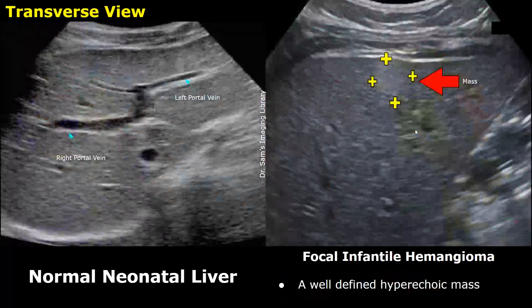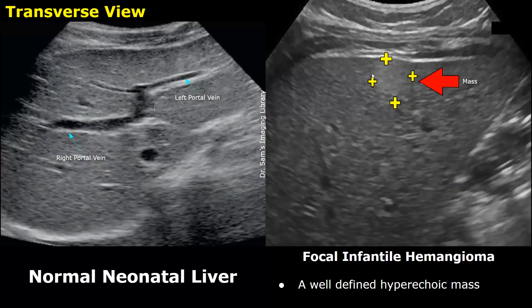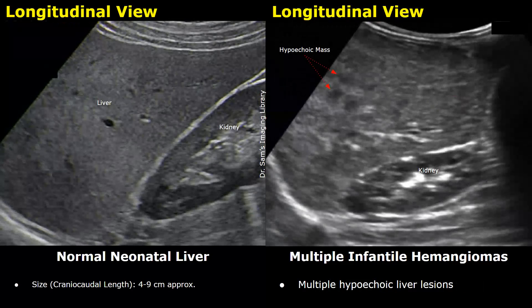Small focal hemangiomas are also seen in some infants, appearing just like in adults — a hyperechoic, well-defined mass in the liver. Multiple hemangiomas can also occur in infants; they usually appear hypoechoic. Here we can see multiple hypoechoic lesions in the liver, which is the typical appearance of multiple infantile hemangiomas.